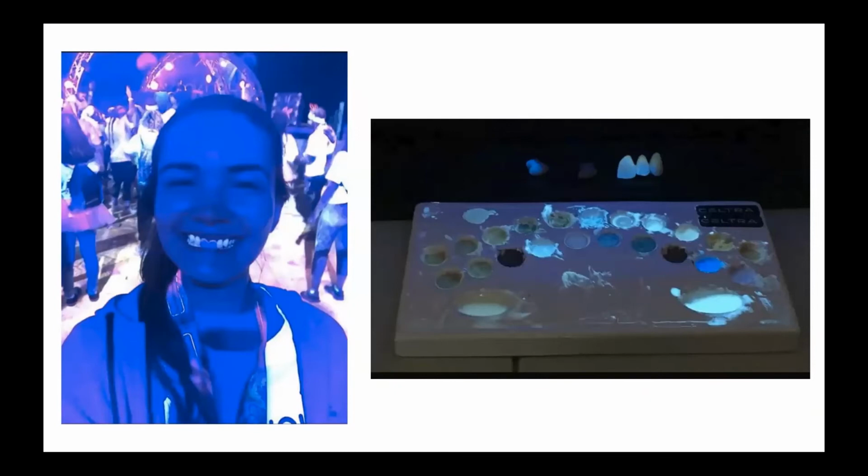Please have a look at this charming young lady, and she had a charming smile until she went to the disco. And it turned out that her monolithic restorations made from zirconia, maybe lithium disilicate, were glazed with not a proper glaze. That glaze wasn't fluorescent, and that's the result of this wrong choice of the dental technician. They looked quite nice in daylight or some artificial light, but in the light of the discos, they reveal this lack of fluorescence.